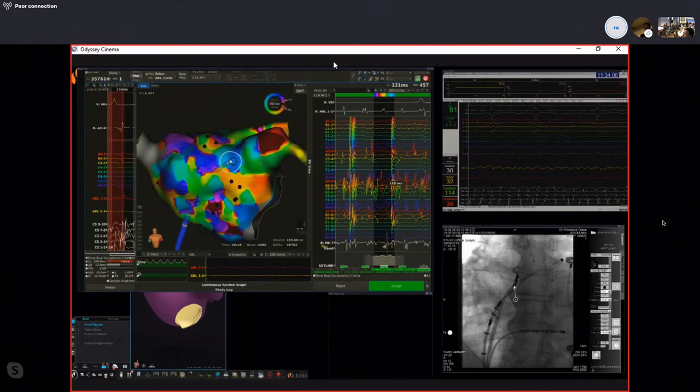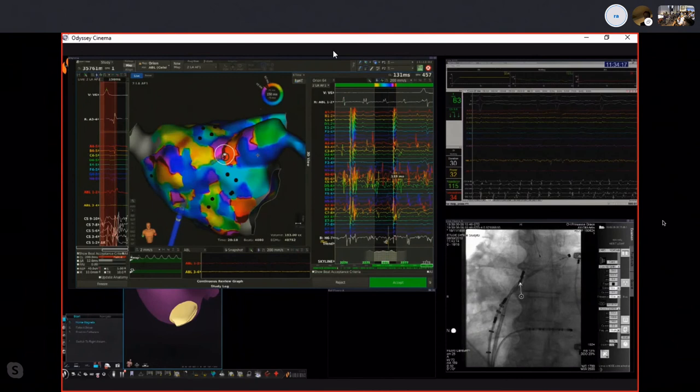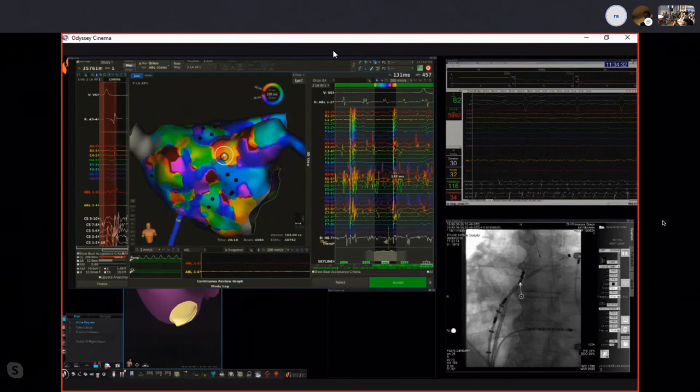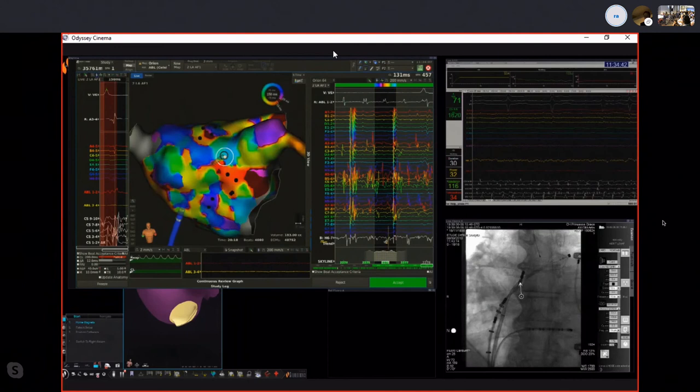I think anybody in the room loves electrograms and mapping and activation mapping, because this is what we all learn first and this is what we all do. So what I would like you to appreciate is that at this spot, for example, we can see an activation wavefront which looks to be rotating around the center point. Would everybody agree with that? Okay, there's no answer, so I shall go on.